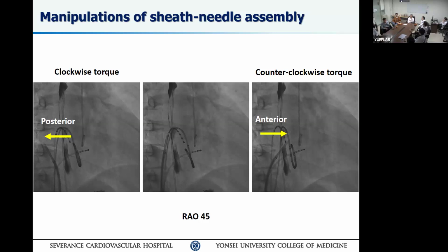So then your needle should be straighter, come up straight and slowly engage. Once you see the anatomic position, just pop the needle and you go right through it, no problem. Those are tricks you have to think about, hemodynamic and anatomic correlations, and so forth. So with lower pressure, in a normal patient, it tends to go more to the left. The higher the left atrial pressure, it's the opposite, the other way around. A lot of times we think, oh, big left atrium, we have to make a bigger curve. No, that is actually the opposite. That's what I'm telling you.